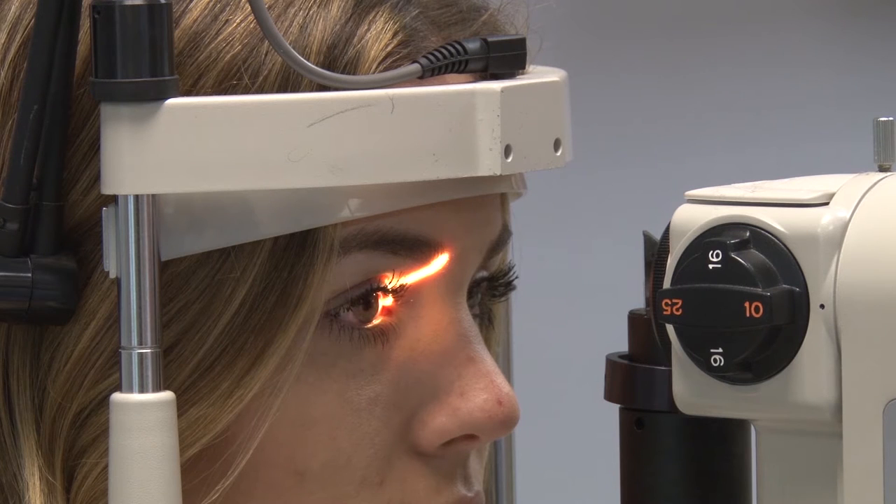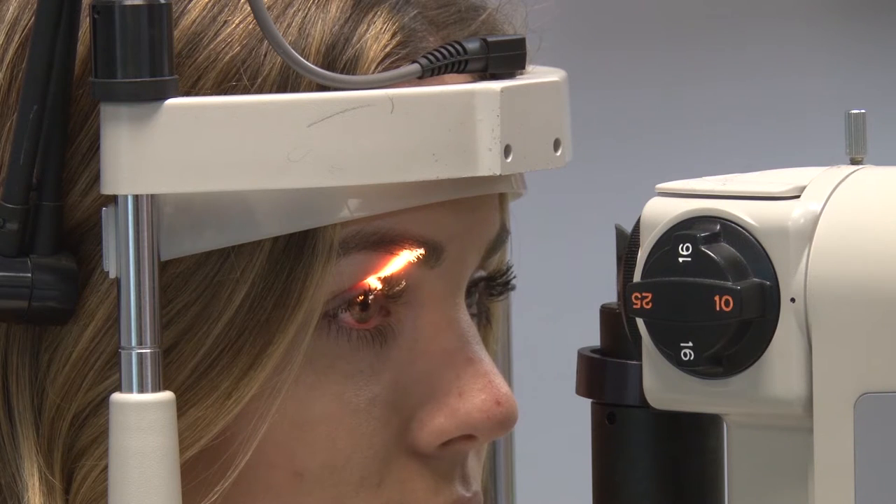I'm coming back across the upper lid margin — again raising it as I go. With the upper lid, the upper lashes are quite long, so you want to make sure that you're focused on the base of the lashes, not the tips. That's where all the relevant findings are going to be. Get to the midpoint, move the light back over to the temporal side, come across, and start lowering it back down.